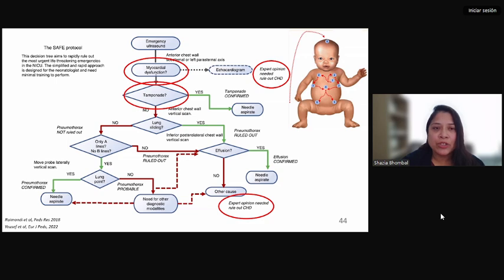Well, what's important to recognize here, especially for those patients who have not had congenital heart disease or a previous echo before to rule out congenital heart disease, is that a couple of different areas in this algorithm talk about getting an expert opinion if you have abnormalities, to rule out congenital heart disease. So if you have myocardial dysfunction, you need to rule out congenital heart disease. Is it possible you have an outflow tract obstruction somewhere? Do you have a coarctation? So there are a couple of different spaces where you want to rule out congenital heart disease. But having this kind of protocol where your providers are trained up so they can put a probe on and triage and intervene.